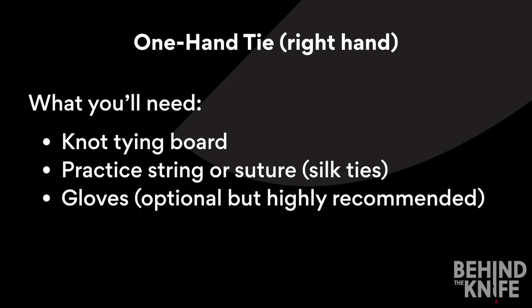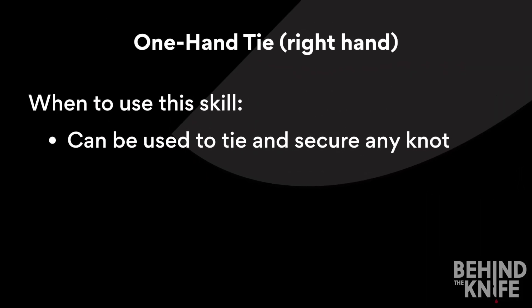It's always best to practice a skill the same way you're going to have to execute it in the operating room. You can use this tie to secure any knot, especially when you may only have one hand free to tie. Some attendings will only want you to use a two-handed knot tie in the operating room, but some are okay with you moving on to this skill, or starting with a one-handed tie if that's what you feel most comfortable with.